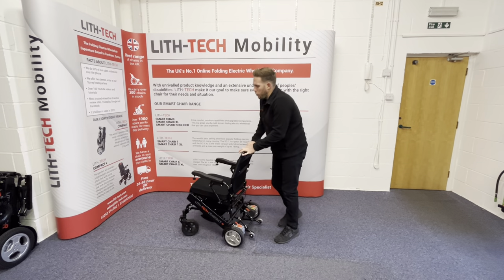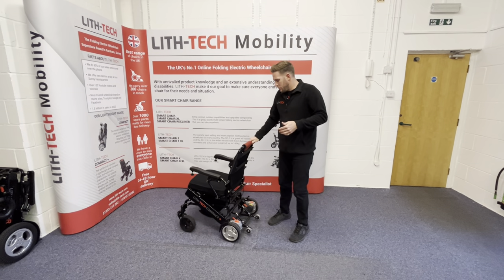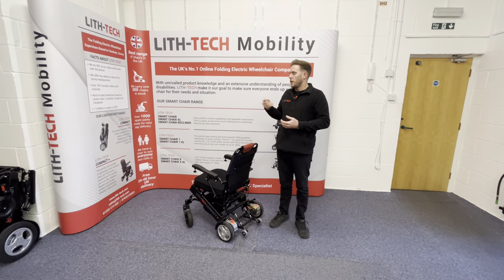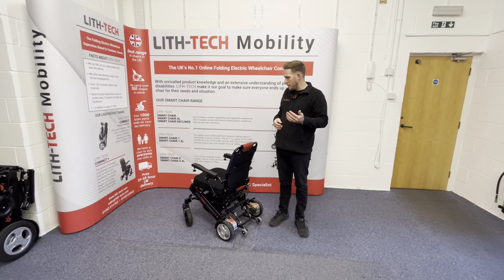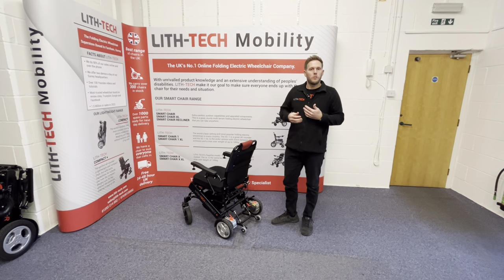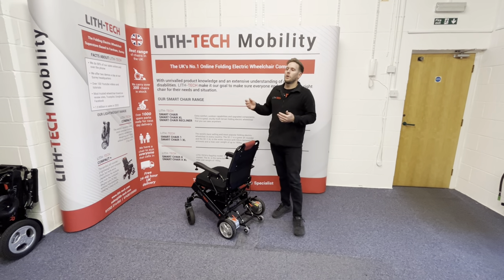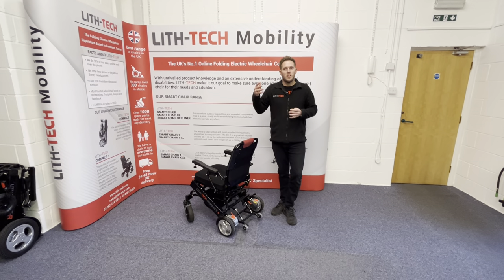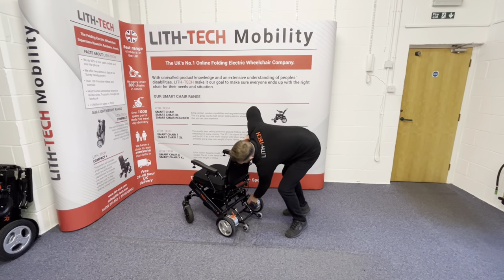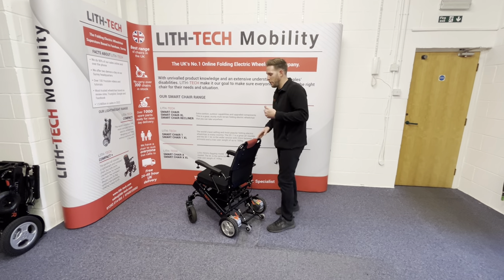People ask all the time why our chairs cost what they do when other brands cost a thousand pounds. To put it in perspective, just these two motors and two batteries together cost the same price as a lot of those chairs — it's the quality of components. The batteries will last four to five years and do much more range. The motors won't break down, they'll last longer, and they'll be much better in freewheel mode. The whole aim is to make your life as easy as possible — a lot of cheaper wheelchairs will do a job, but they won't succeed to their full extent of making someone's life as easy as it could possibly be.